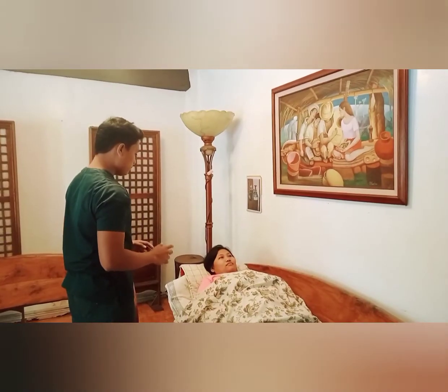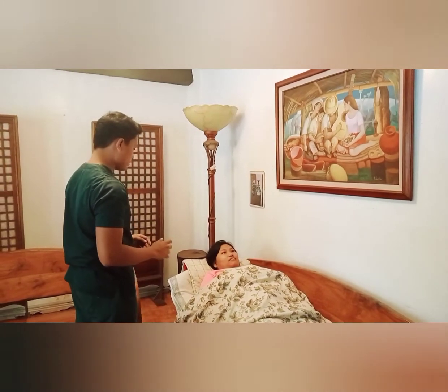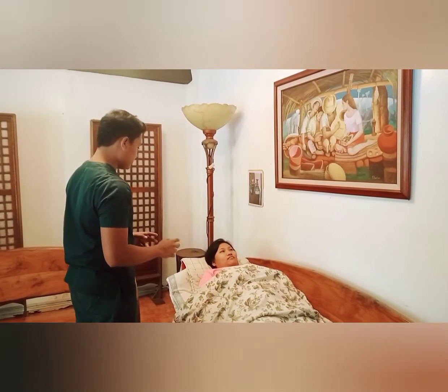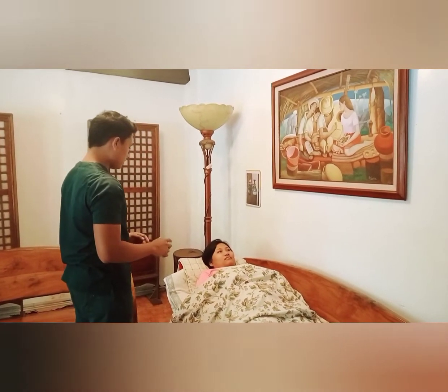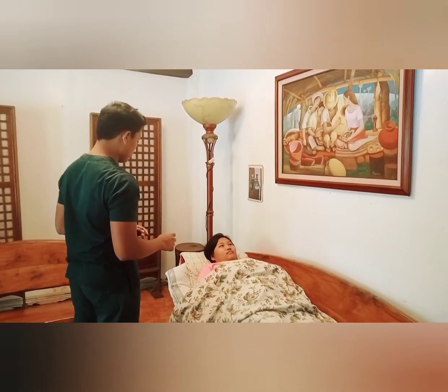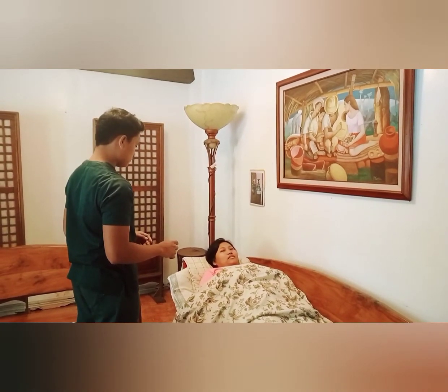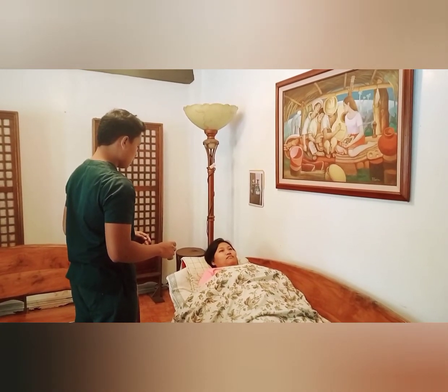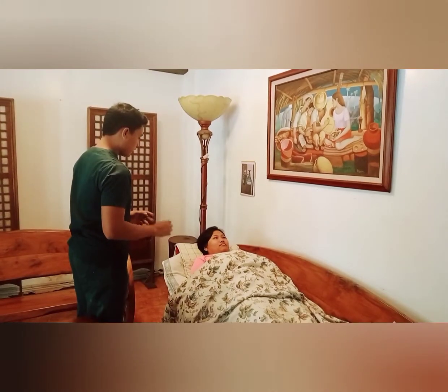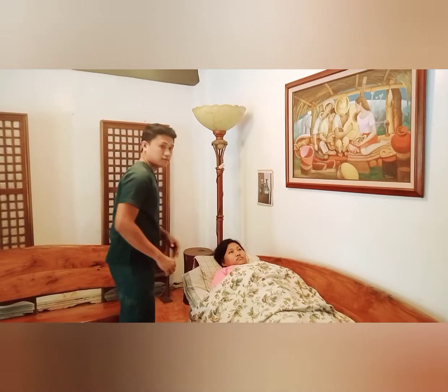So, the purpose of this procedure, ma'am, is to prevent hypoxemia and hypoxia, and also to alleviate the associated struggle to breathe. Before we start the procedure, can you state your name, ma'am? My name is Blessed George Morales and my birthday is January 2005. Okay, nice to meet you, ma'am. I will assemble the equipment and I will be back.